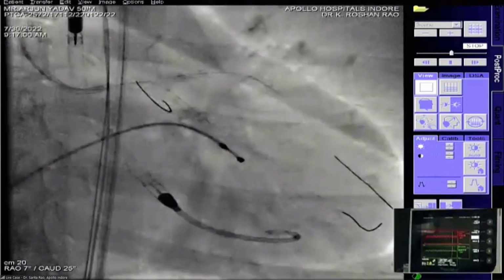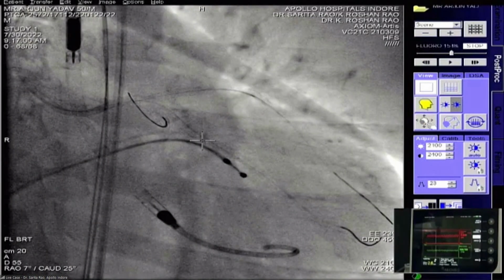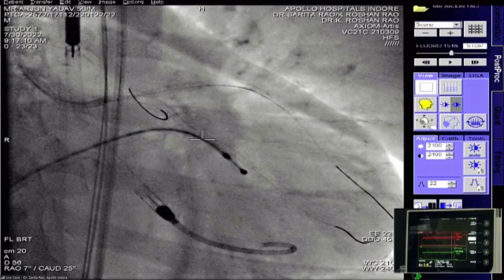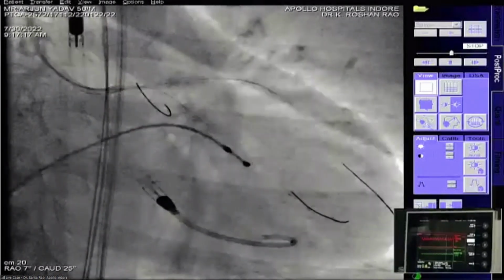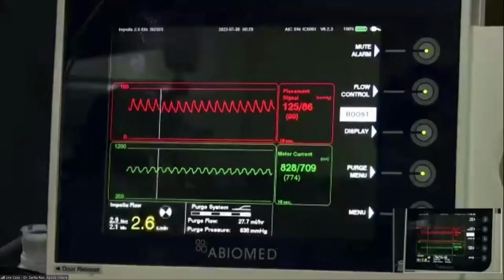That's an important point madam is making: when you're inflating a stent in the left main, you have to be relatively quick. Though impeller support is there, many of us don't have the luxury of having an impeller. So in doing such things, you have to be very quick and plan everything properly. If you inflate it longer, especially if the patient has LV dysfunction, a vicious circle develops, and then it will be a problem. So always make sure that you're quick, at the same time be effective, and go up to the right pressures.